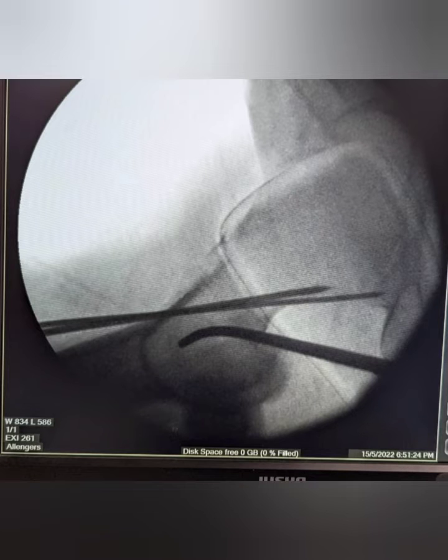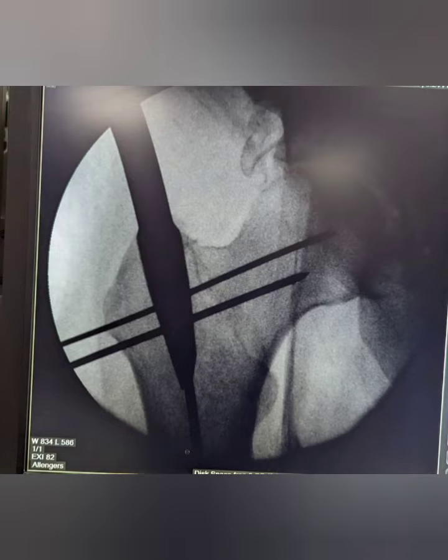Once we are ok with the position, we start with the bone awl to make our entry point.